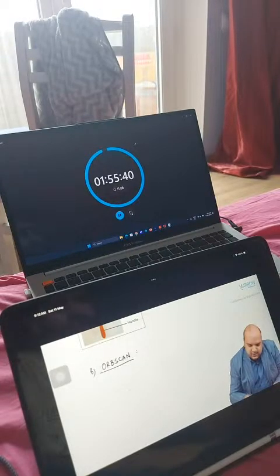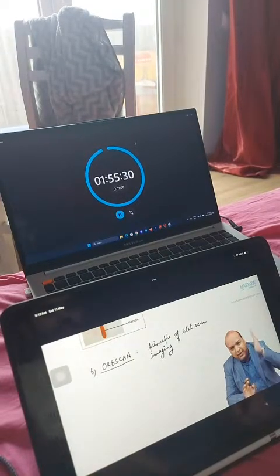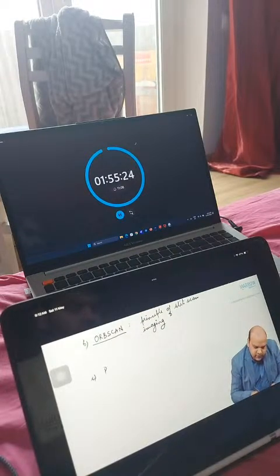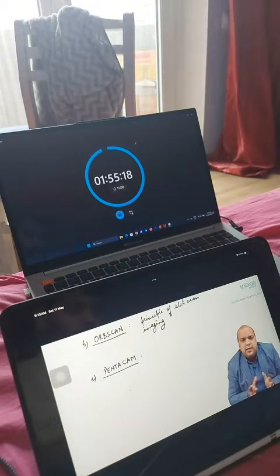This is a machine based on the principle of slit scan imaging. So this works just like a slit lamp. It throws an oblique light and we are able to see each part of the cornea in scans. Not going into the detail, not important. Then the last instrument which we use commonly, guys, you will see this name being commonly used in the ophthalmology department if you are posted or if you have ever been into a cornea clinic, is Pentacam.